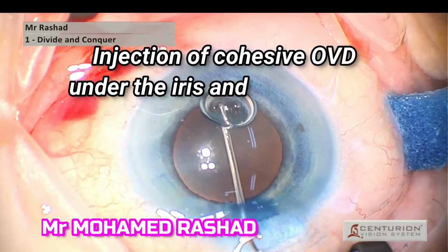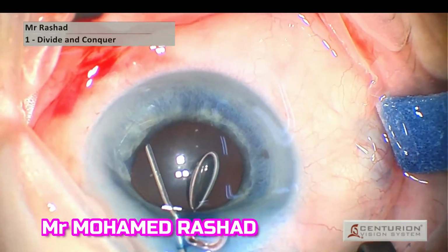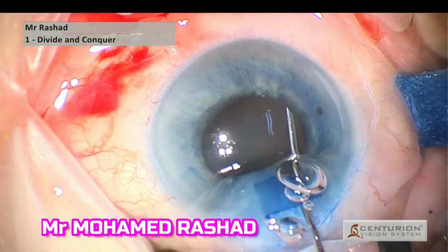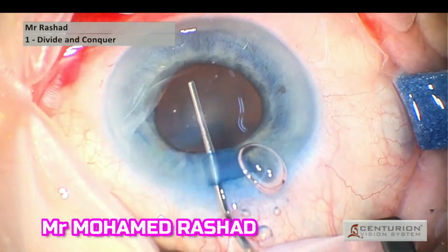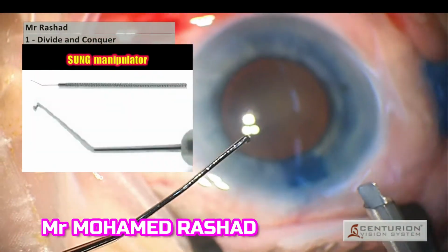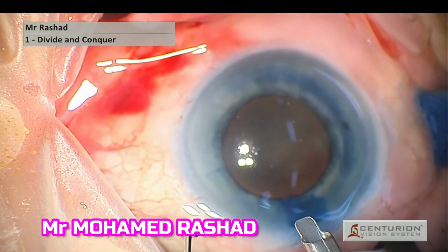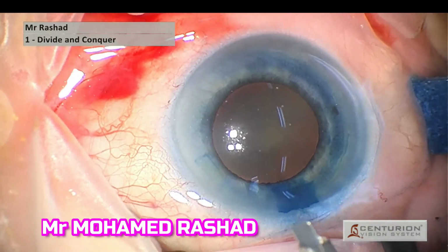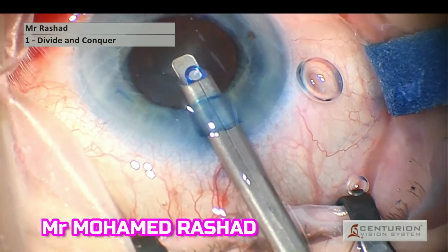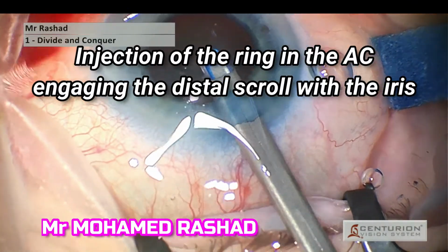The most important thing is to inject cohesive OVD under the edge of the iris and fill the AC as well because it is very shallow. By using the Sinskey manipulator with a two-handed technique, we inject the ring slowly, and you can see the patient is moving her eyes and her head.